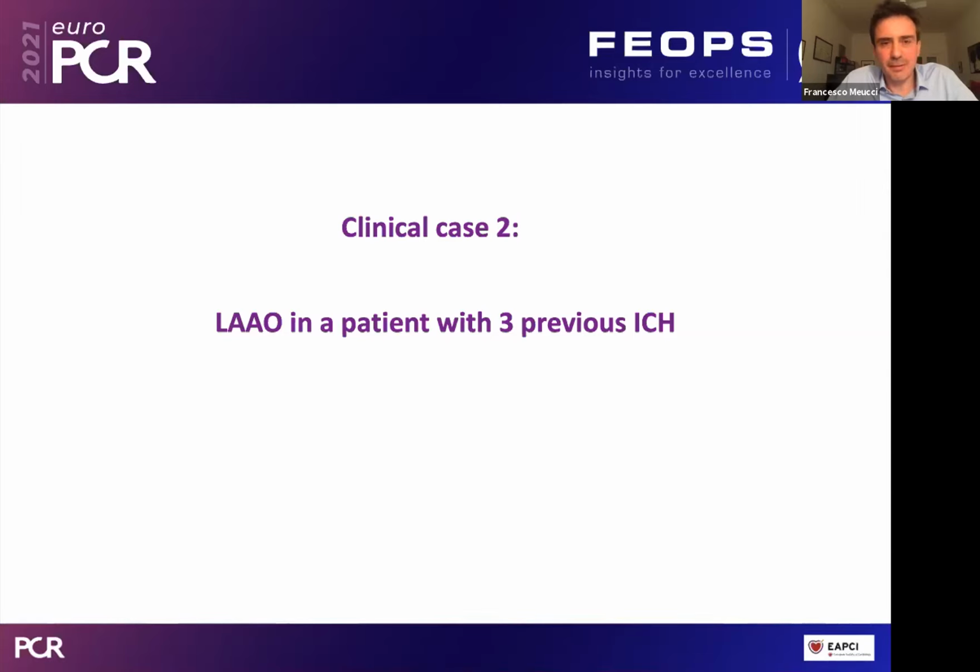Thank you for the question, because this is the other point. When you try to simulate, you reach, as a company, in my opinion, a very good level of prediction, as we have seen, and we will see in other cases, of prediction of device positioning and sizing. The thing that is to be done yet is the simulation of the trajectory of the transeptal puncture and of the trajectory of the delivery system. That could be a tricky part of the procedure at all. So this is my answer.